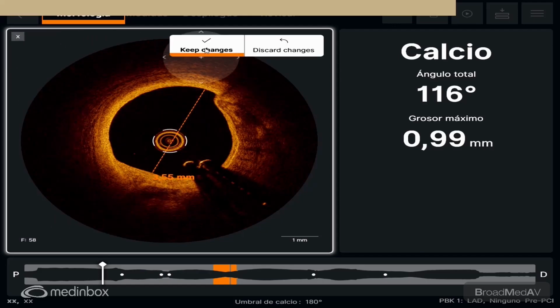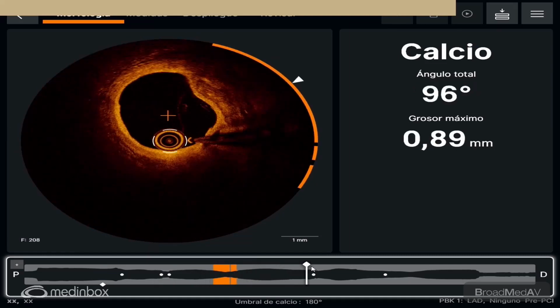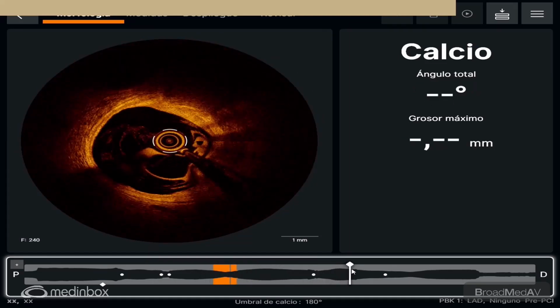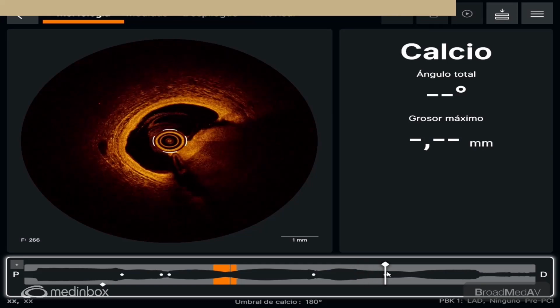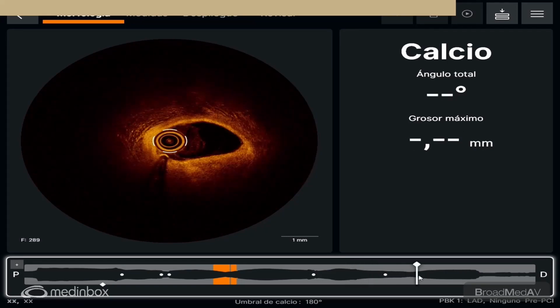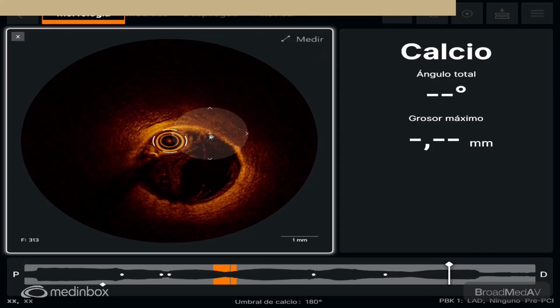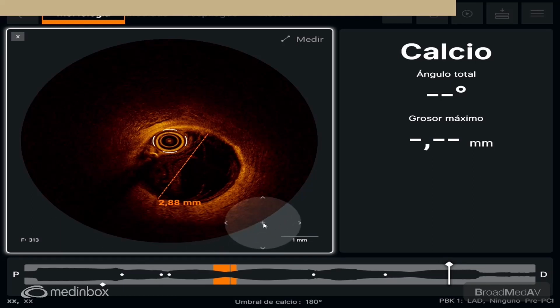It's 3.5. And the distal one? The distal to the aneurysm? Yeah. Let's see. This is a double loop? No, it's probably blood, no? Probably, because of the aneurysm. And the distal part there probably is the landing. Yeah, maybe here. 3 or? Yeah, more or less 3.